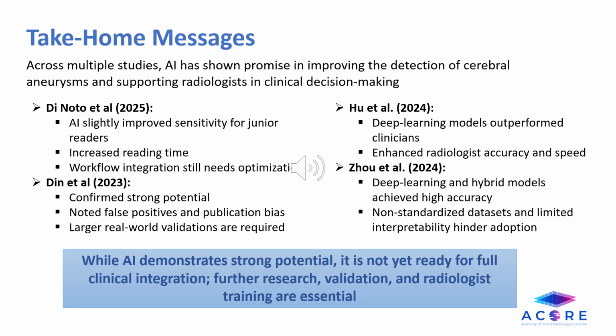We still need larger standardized studies, better validation, and ongoing training, not only for the models, but also for the clinicians using them. Overall, AI should be viewed as a tool that complements radiologists, providing valuable support in clinical decision-making and patient care.